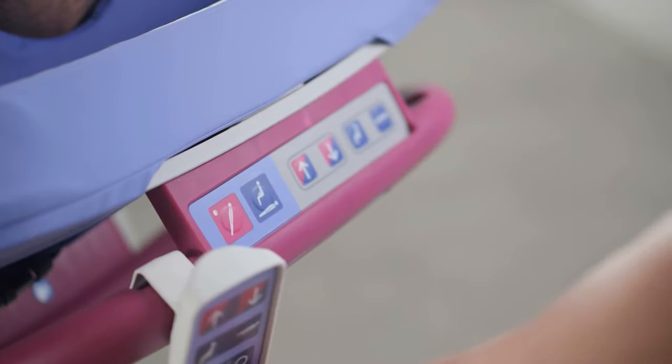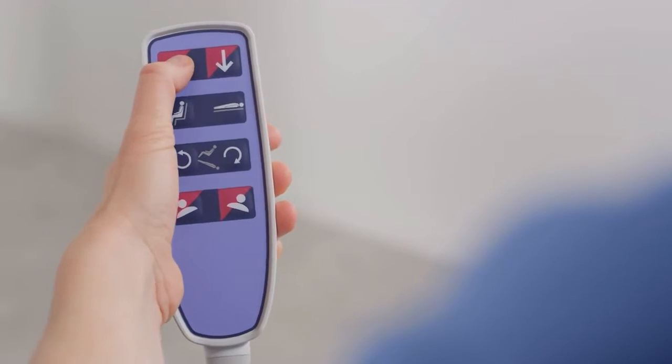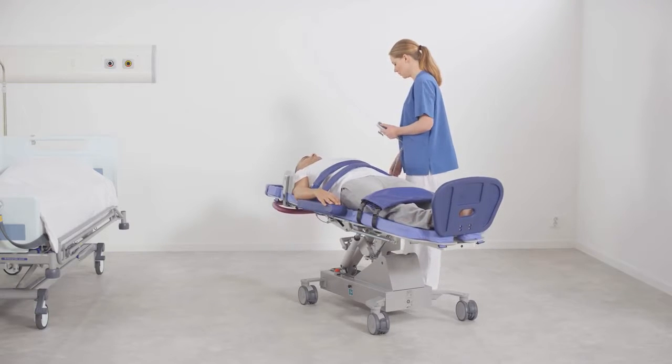Press and hold the standing mode button on the control panel until the LED light has changed to a constant light. The stretcher can now be raised into a tilt table position by pressing the up button on the hand control.